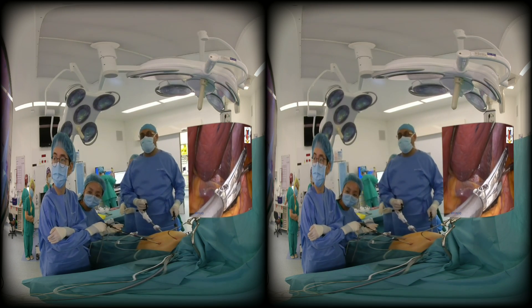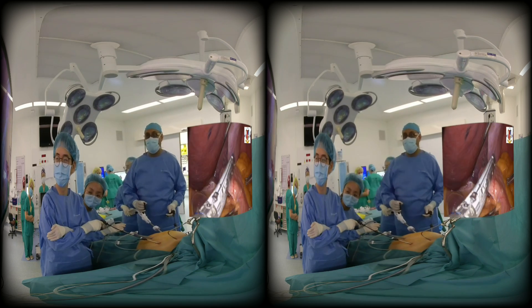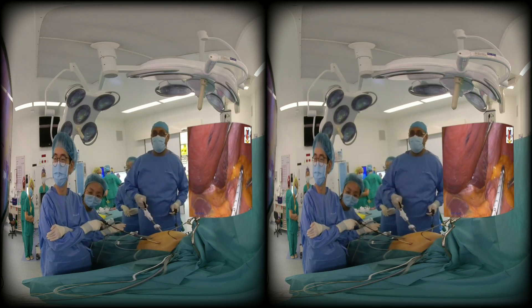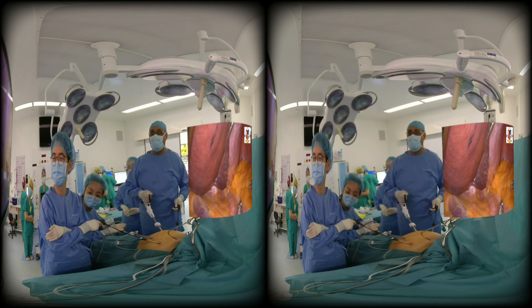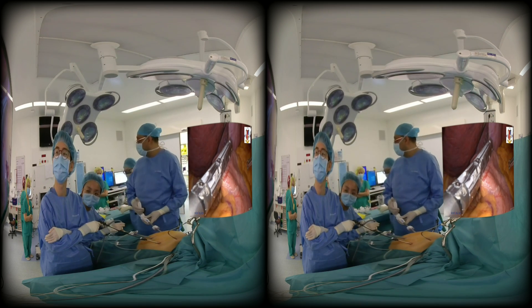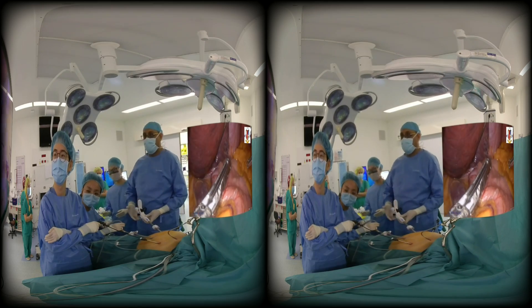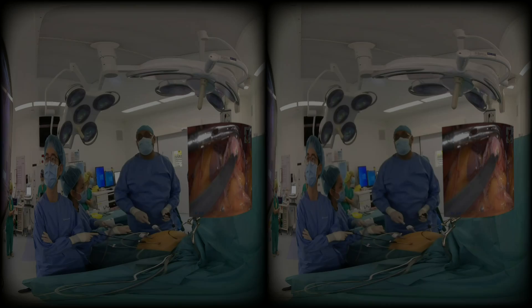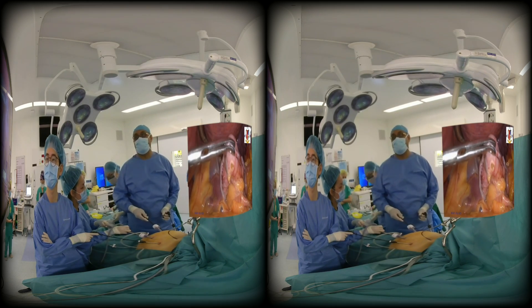Then you take a stapler. I would normally aim the stapler towards the tip of the left shoulder. Although I articulated it earlier, a little bit of articulation is undone. So it's actually quite a slant cut, aiming towards the tip of the left shoulder. That's the first staple fired. You get an entry and dilate the gastrostomy using a right angle.